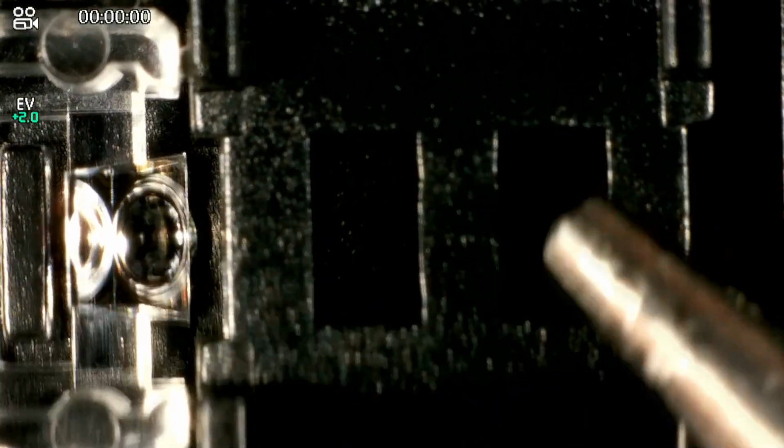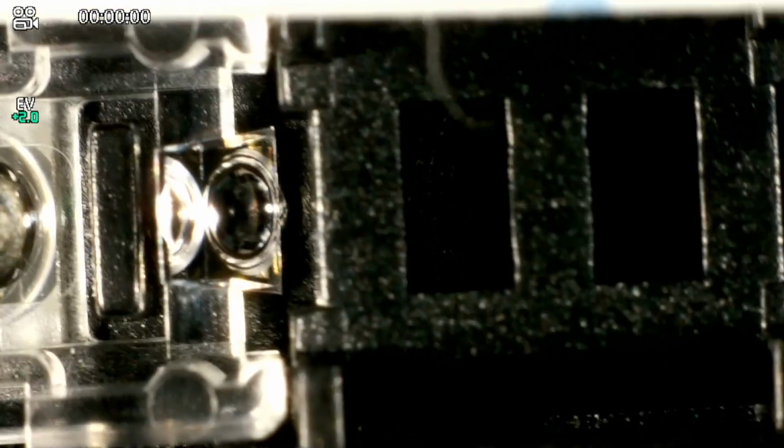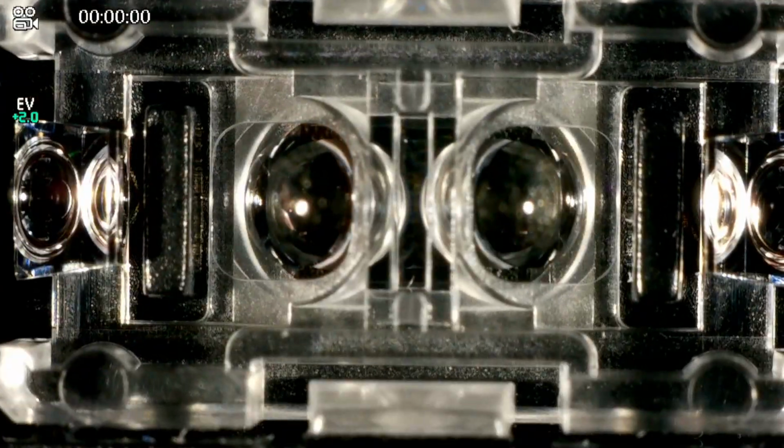And these holes line up with the lines on the strip. Here's the other one, actually, because I had two of them. And interestingly, on this one, there's only one line. The other one does not show up. So this one, either the line disappeared over time, or maybe something else is going on. But yeah, that kind of makes sense. What is going on in terms of its design now? A lot of custom molded pieces and so on, and clear optics are even more expensive, of course. Everything's plastic, nonetheless.